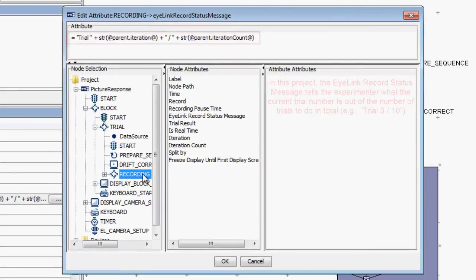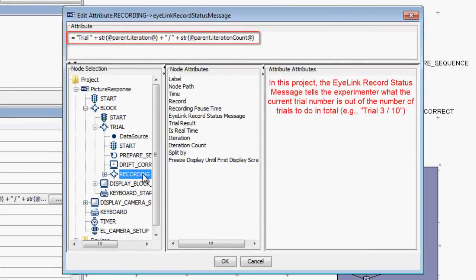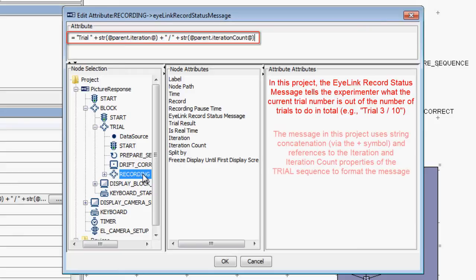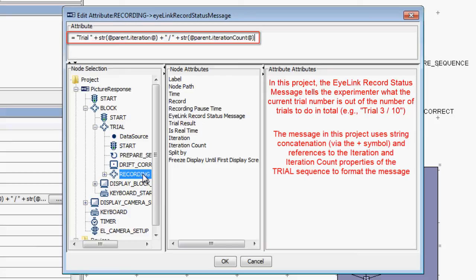In this project, our message gives feedback telling the experimenter the current trial number and how many trials are in the project in total. This message uses string concatenation and references to the iteration and iteration count property of the trial sequence to create a string that contains the properly formatted message text.